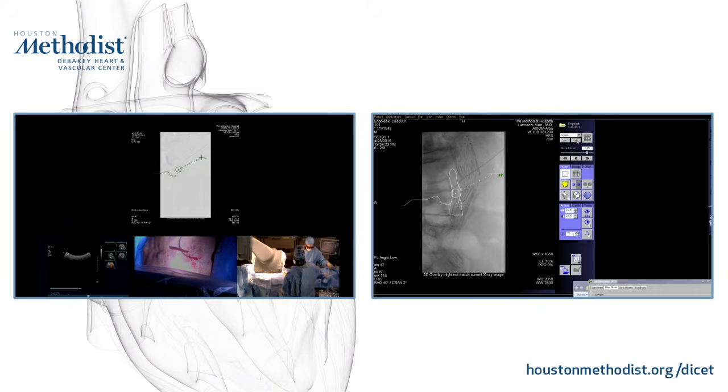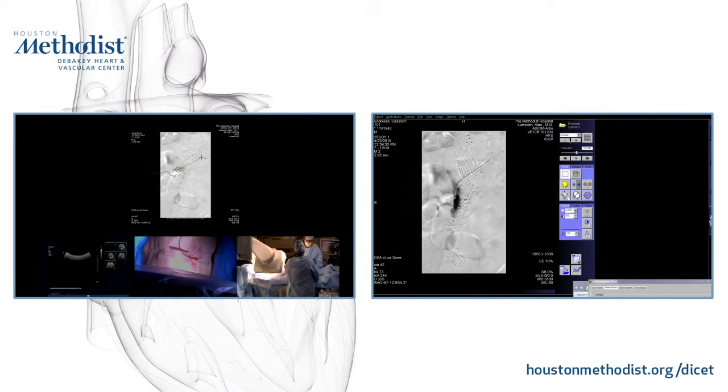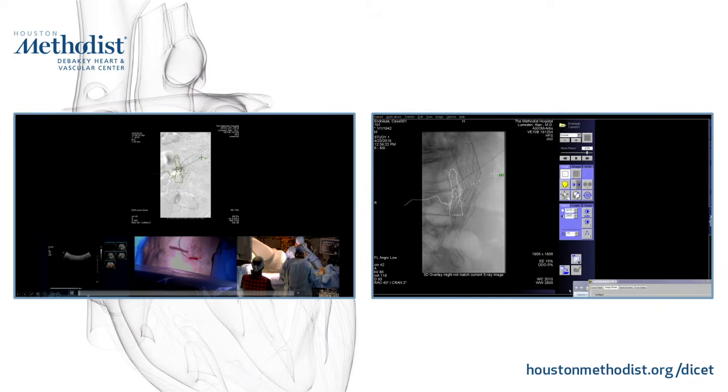After the needle is in, we gain wire access. Okay, so tell us what these different lines are that we're looking at here. So what you're seeing in the left image is the needle path that we planned coming from the anterior abdominal wall, and we exchange the needle for the sheath and the catheter, and that's coming in. This wire, this red or orange line, is the L4 lumbar from the right side that we have planned. And this little contour that we have mapped is the endoleak cavity that we saw in the CT. Right, so that helps identify how many coils you need to use to pack that entire endoleak cavity.